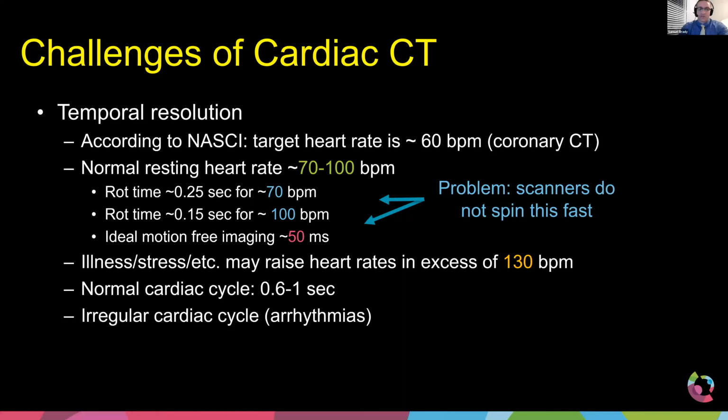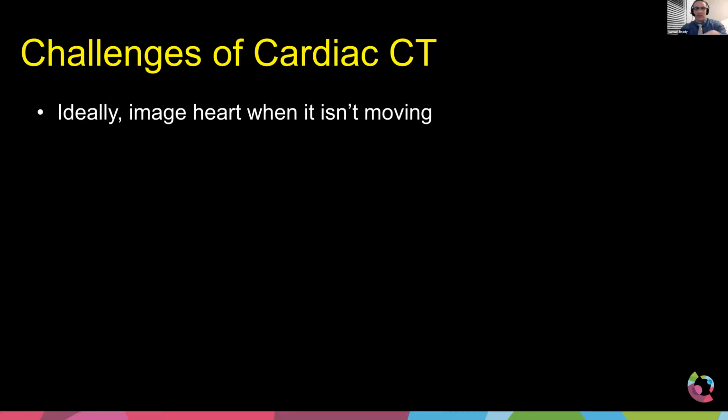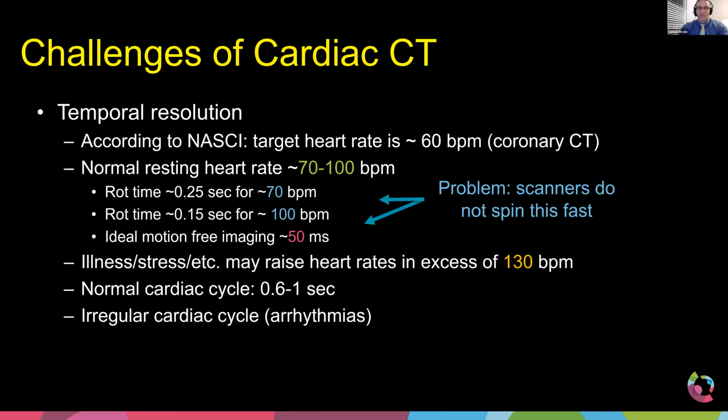There are always going to be times when we might have an arrhythmia, or something along the diastolic to systolic spectrum just changes. We skip a beat, or something happens, and something's just not right. So these are the three things we need to optimize. Obviously, the rate, the beats per minute.